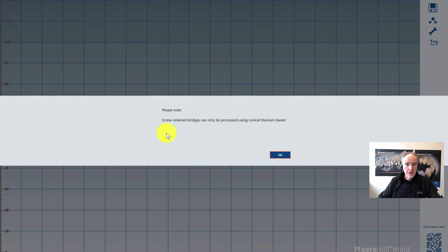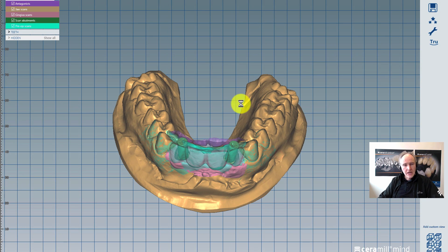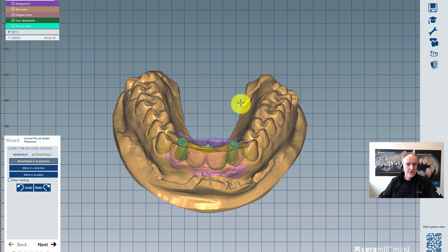The first thing is that you get a note: only with conical titanium bases is it possible to make screw retained bridges. You can click OK and then continue.